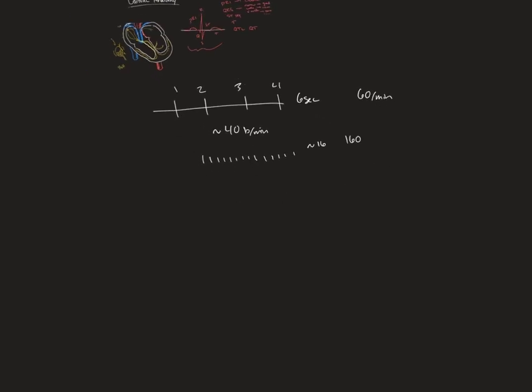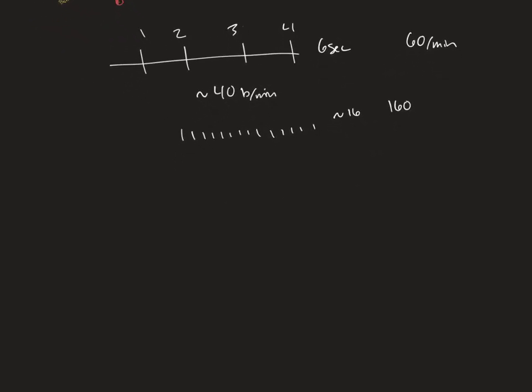But we'll go into that right after this. On a 12 lead, and this is really important, one of my biggest pet peeves, and maybe I don't know something, is having somebody hand me a rhythm strip with no 12 lead and saying that someone has a left bundle branch block or a right bundle branch block or whatever.